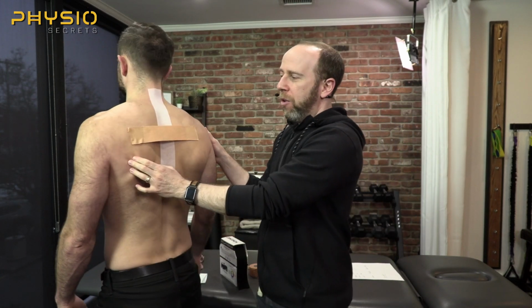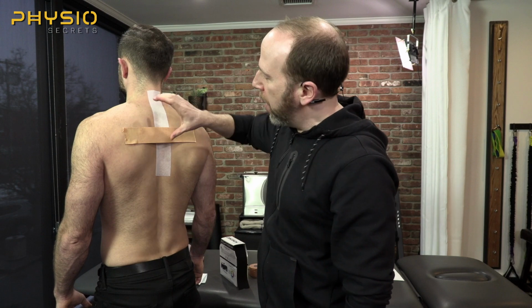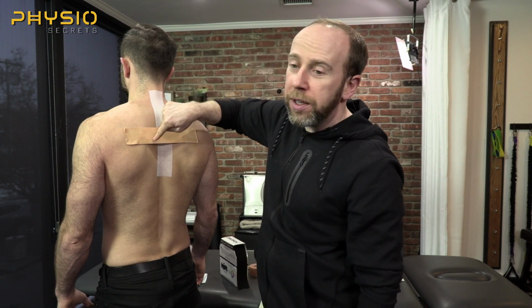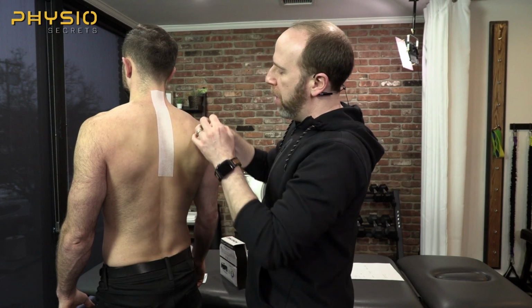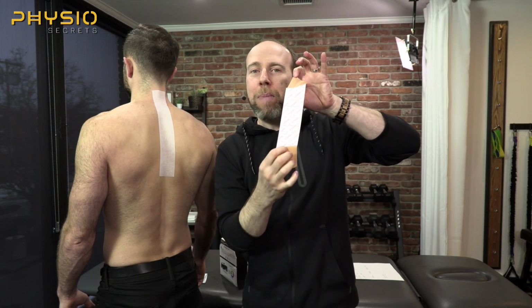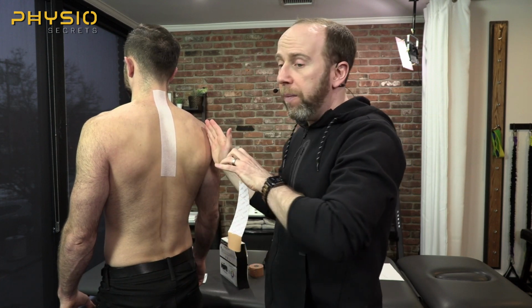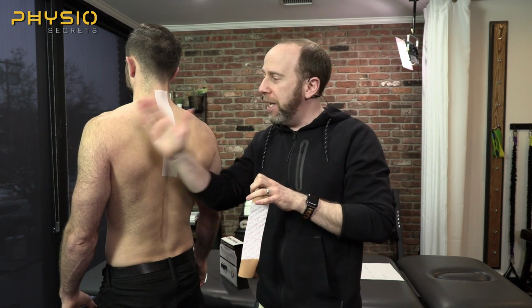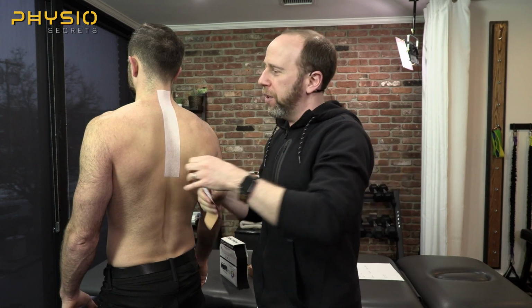All right, so this is essentially where I'm going. I'm going to be taping him right in this position with his scapula retracted with the intention of getting some feedback. But I'm doing this so you guys can see how much better using coverall is than using any kind of flexible tape. So there's a couple of different options. Some people will pull off the entire backing, then apply the tape. Some people will apply it from one end to the other. Don't be afraid of doing that. Remember, he's not going to feel which direction you applied the tape once you actually take everything off. So that's what I'm going to do.